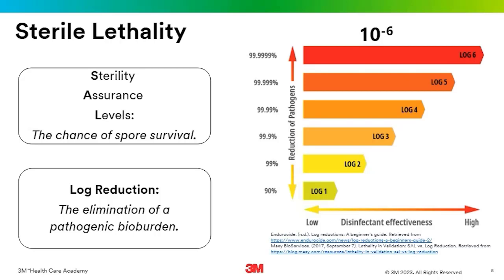But in the validation process, log reduction demonstrates how valuable and practical the sterilization cycle is, showing the potential of the sterilization process. It also gives our manufacturers, right, the people making the autoclaves and all those IFUs, the idea of how impactful the sterilization process is on a product.